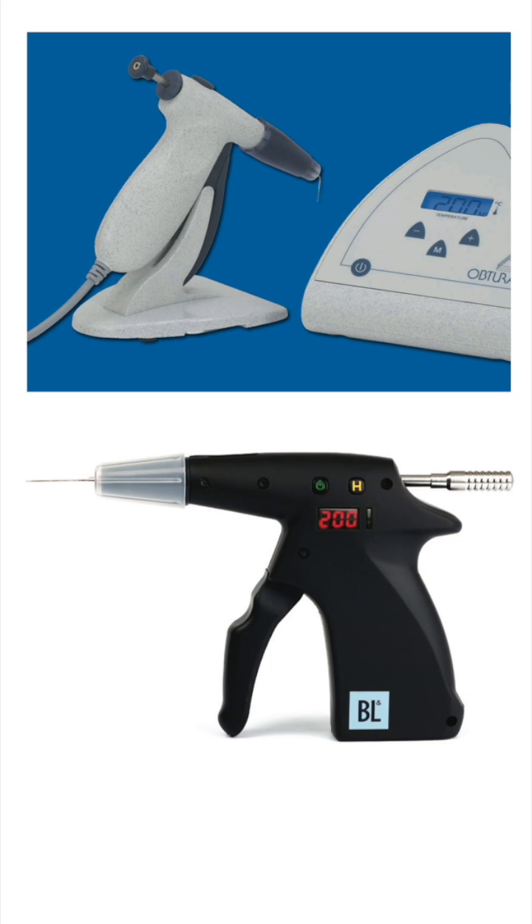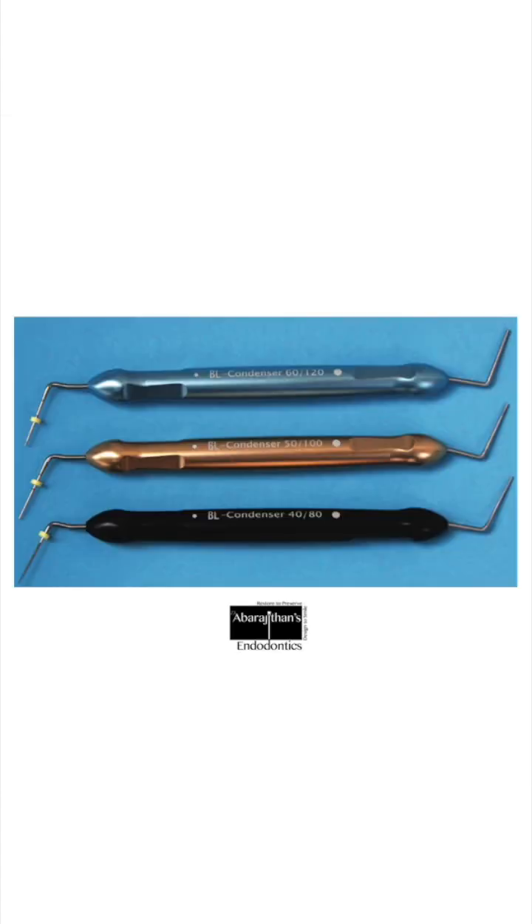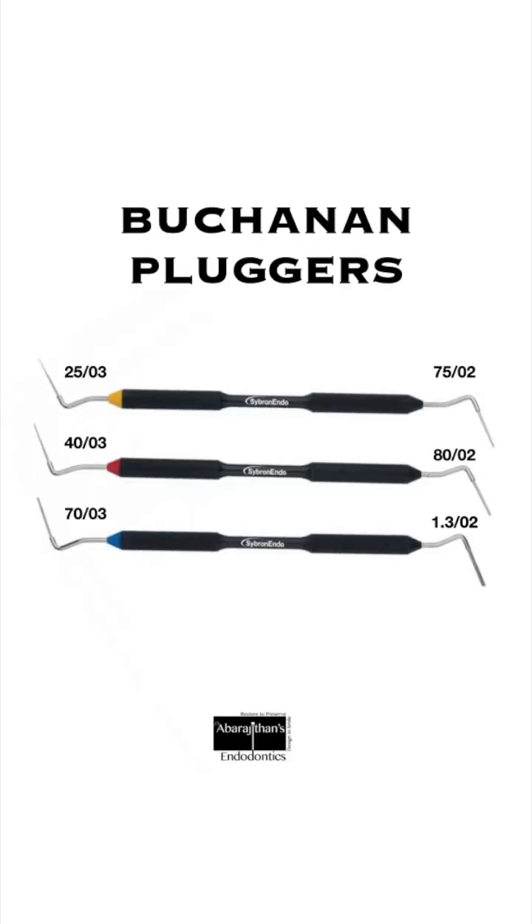To do this technique we need the down-pack unit, or the colloquially used term is the obturation gun, with which you can inject molten gutta-percha into the canal. We also need a good set of hand pluggers, preferably nickel titanium. I use these Buchanan pluggers, which are available in three sizes and come with a nickel titanium tip.